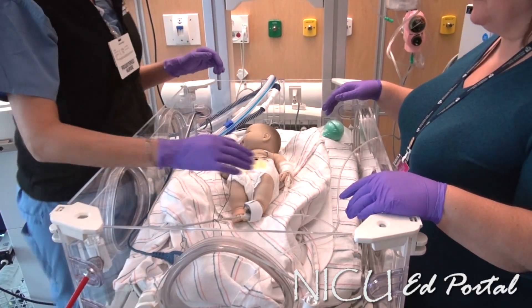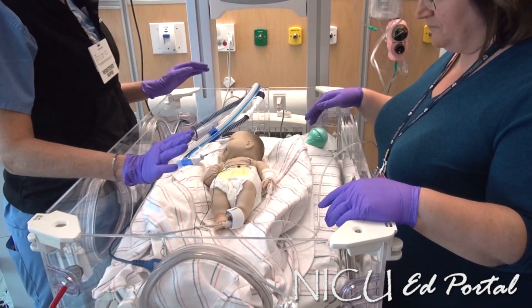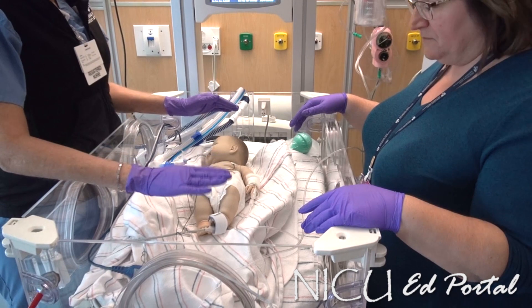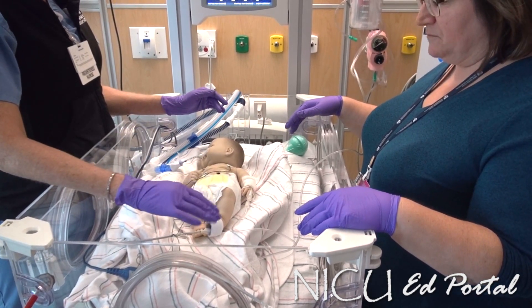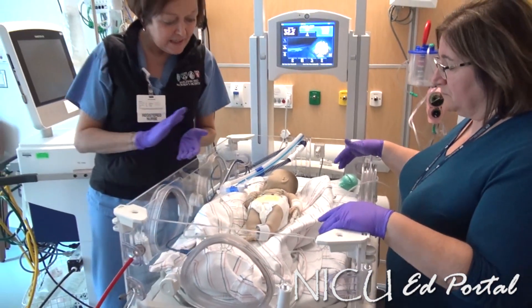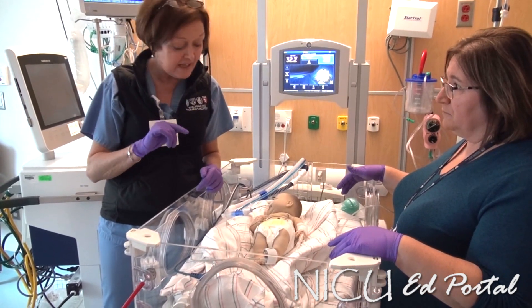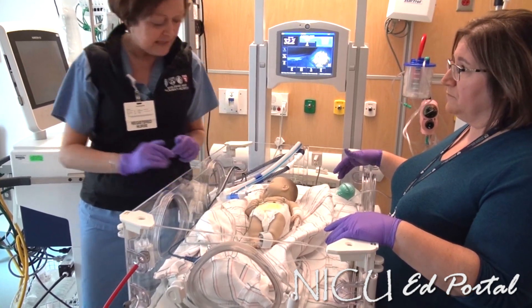This is baby Patrick, and we're taking him to our own MRI suite here in the NICU, which is slightly different than taking him downstairs. We're going to get him ready. He is intubated and has an IV running, so there are considerations for the transport and for when he gets into the MRI suite. We're going to use equipment specifically unique to our own MRI suite, different from what we use when transporting downstairs to the Lee Bell Centre.